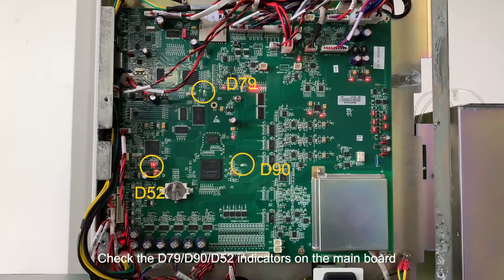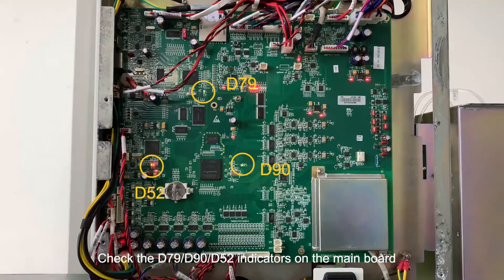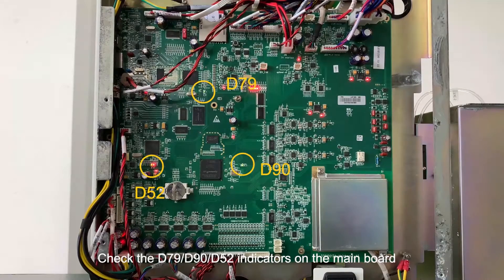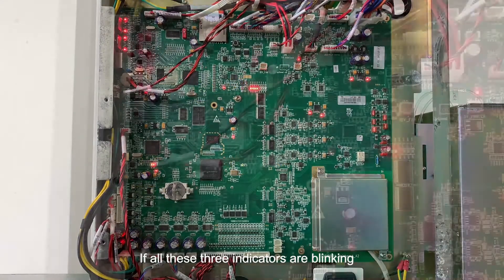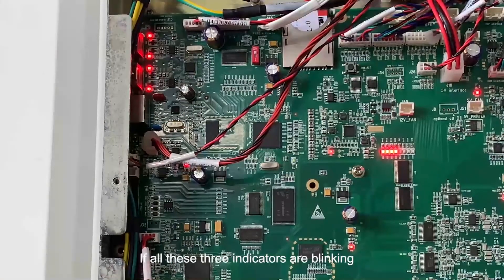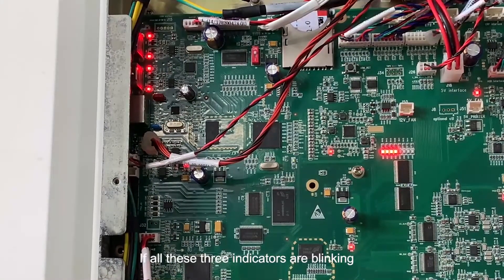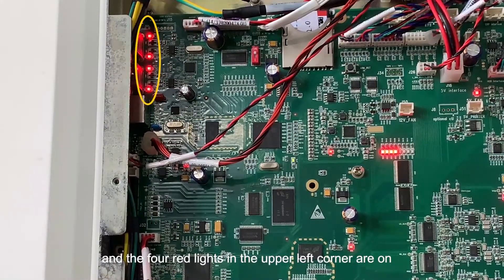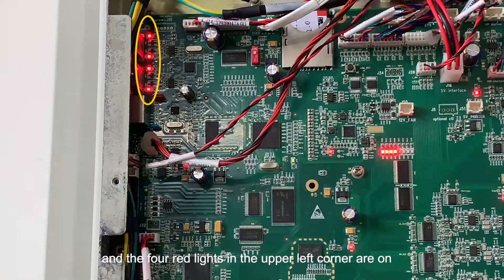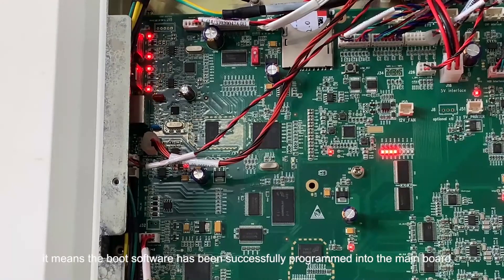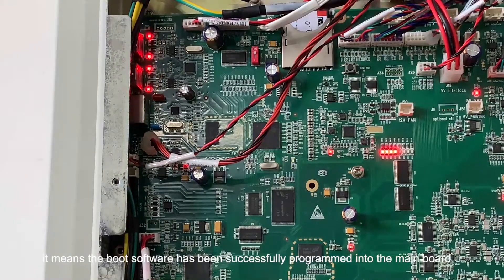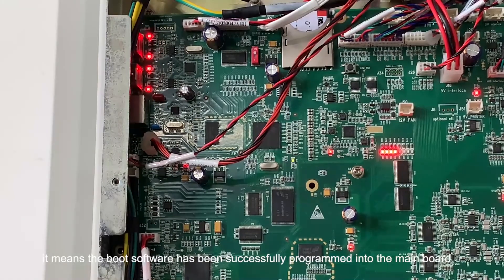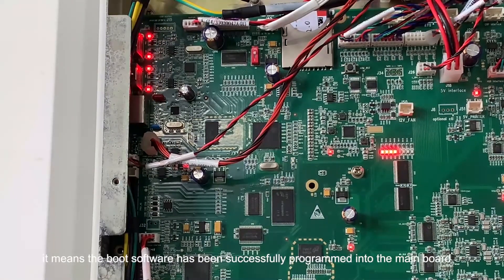Check the D79, D90, D52 indicators on the main board. If all these three indicators are blinking, and the four red lights in the upper left corner are on, it means the boot software has been successfully programmed into the main board.